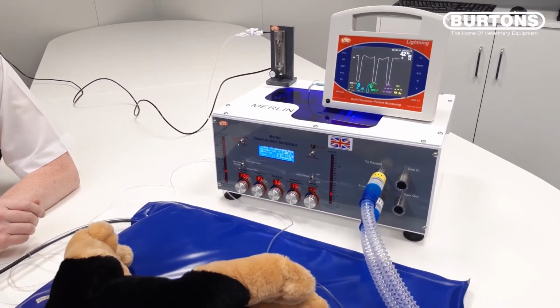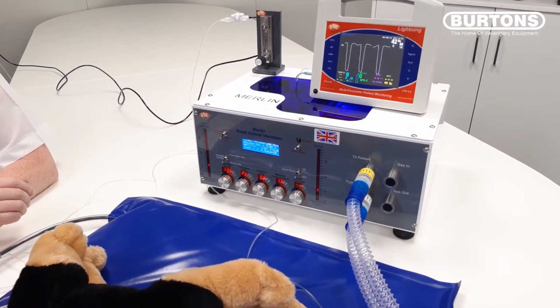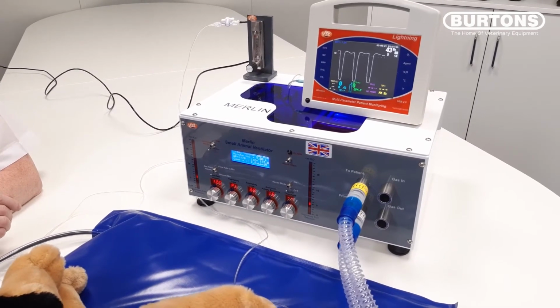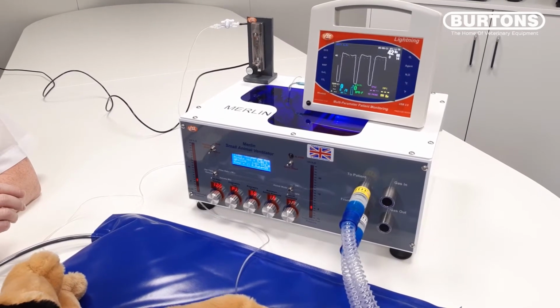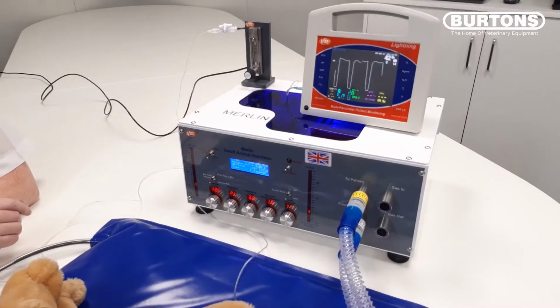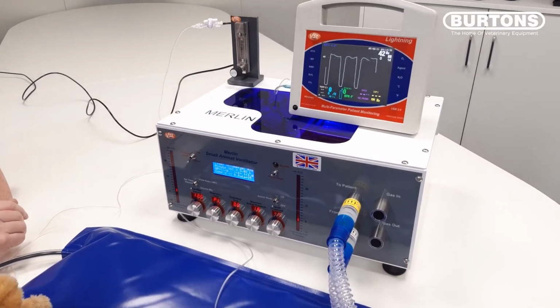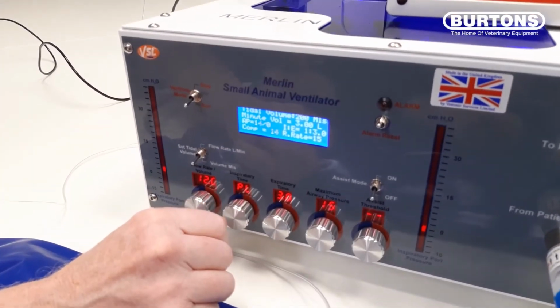an anaesthetised patient. I'm going to change the respiratory rate now to increase the minute volume from this patient, and our prediction would be that by so doing, with a constant production of CO2 from an animal, if we increase the minute volume, we're going to see a fall in the end tidal CO2 value. So I'm going to go from a minute volume of 3 litres a minute, as shown here on the screen, indicated by a respiratory rate of 15.